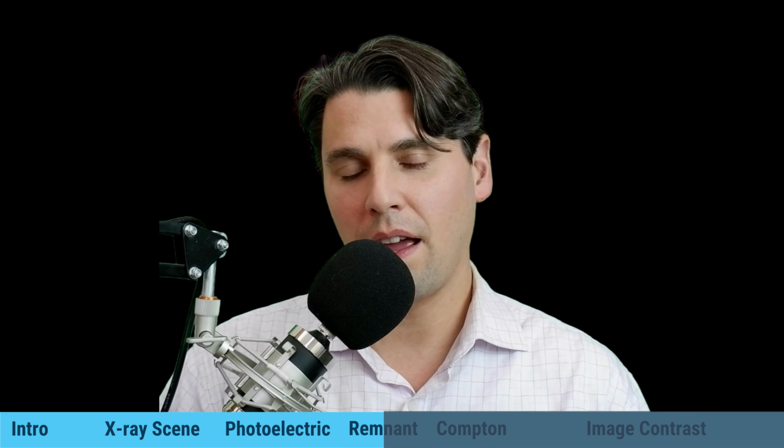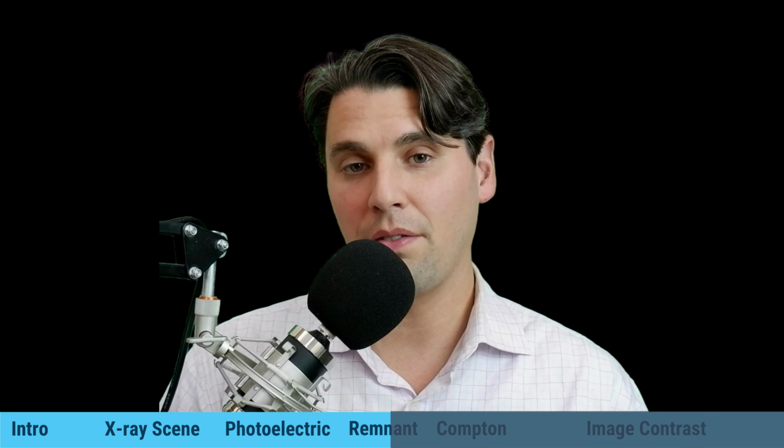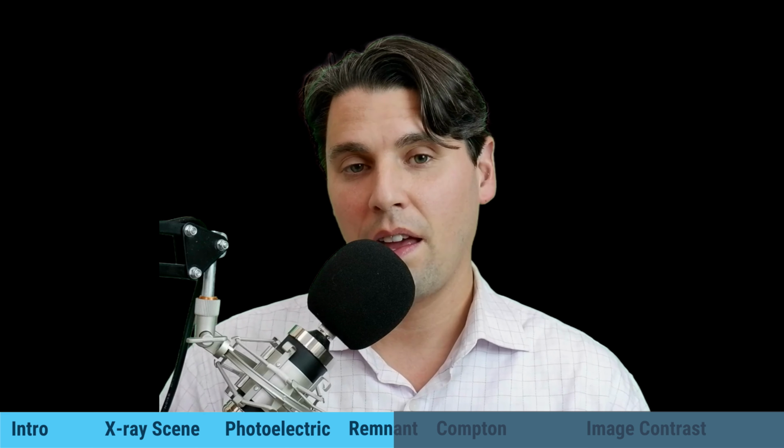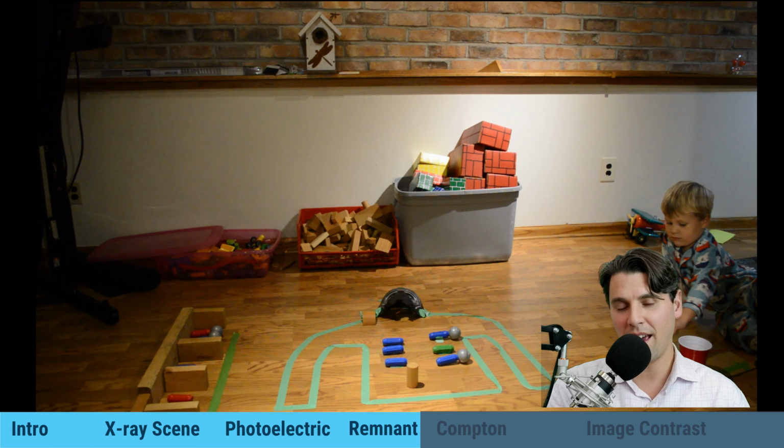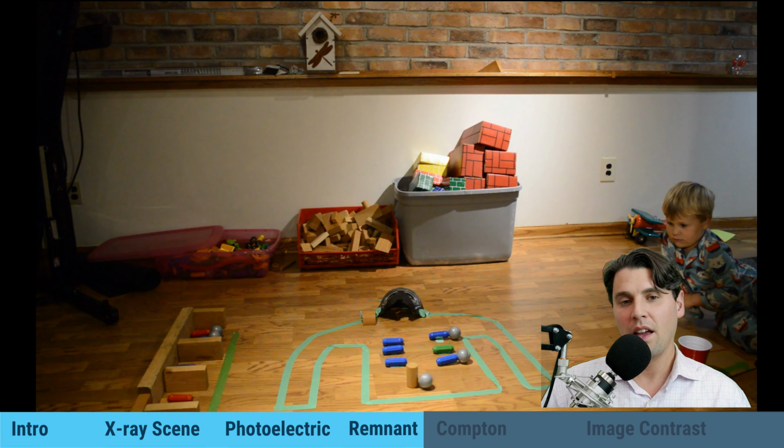So here's what happens as the X-ray comes through. If the X-ray coming out of the X-ray tube interacts with the patient via Compton scattering, that X-ray will come off at some angle and will not deposit all of its energy locally. It will deposit some of its energy locally, but a significant fraction of its energy could go through with that X-ray as it passes through, scattering more to the side.